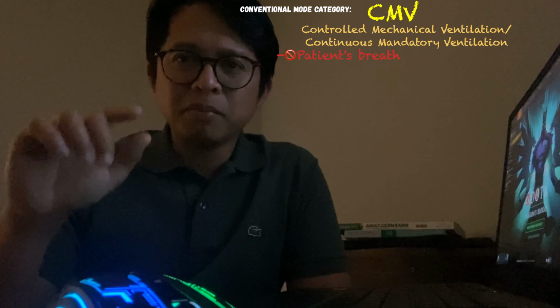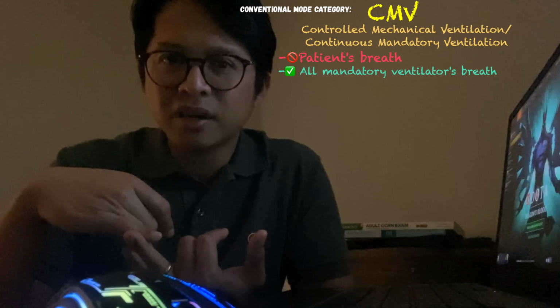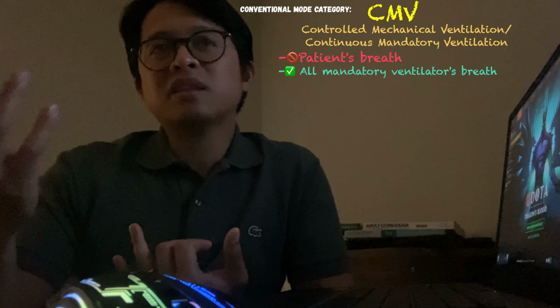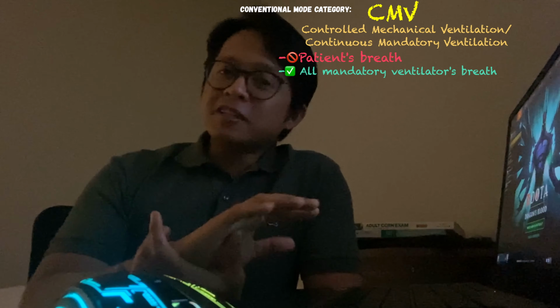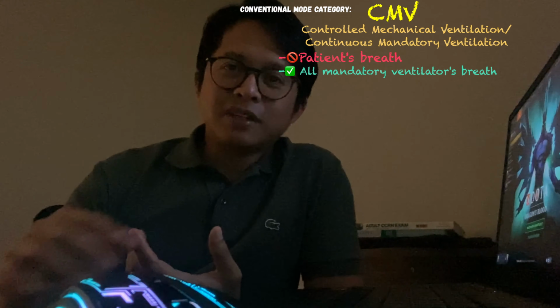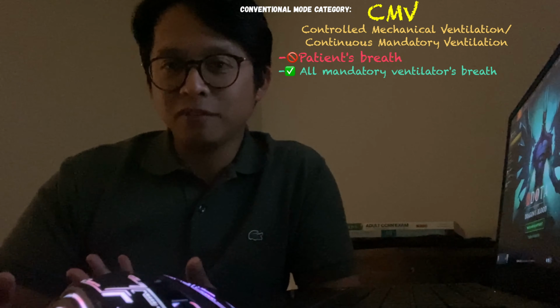Operators set parameters like the tidal volume and the RR to generate the desired minute ventilation. The patient cannot trigger a ventilation even if they wanted to. So that is the CMV mode.